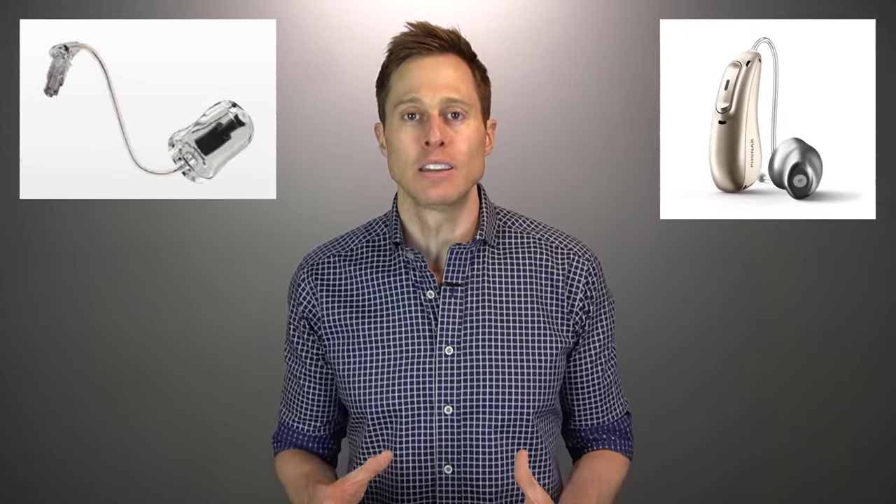Third, if you can use a standard, medium, or power receiver, you'll want to select the appropriate rubber dome. There are tulip domes, open domes, vented domes, and power domes, each in different diameters with different acoustic properties. Tulip and open domes are good for normal low-frequency hearing with mild to moderate high-frequency loss. Vented domes suit mild low-frequency loss up to moderately severe high-frequency loss. Power domes are for moderate to severe low-frequency loss up to severe high-frequency loss, though power receiver users are still better off with a custom ear mold.